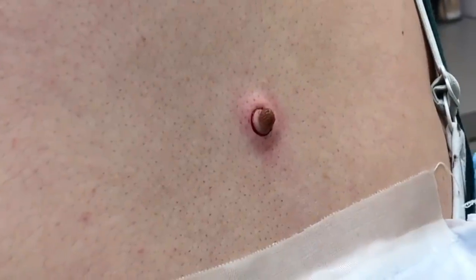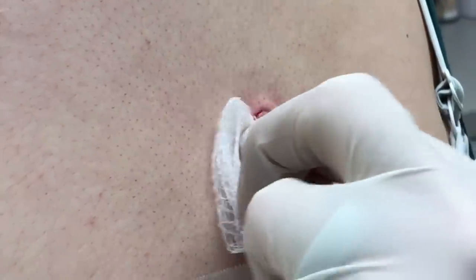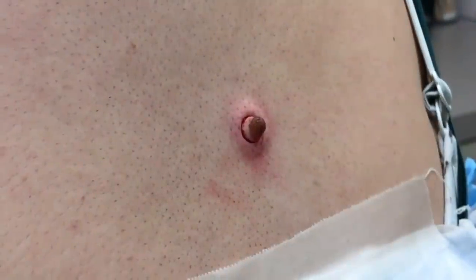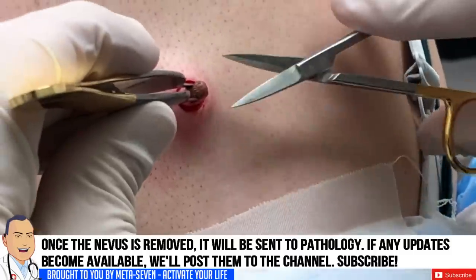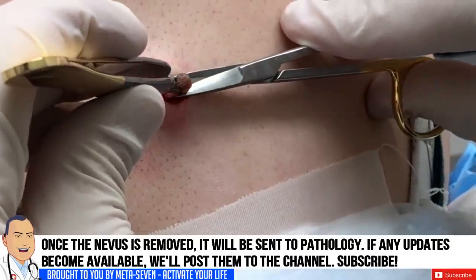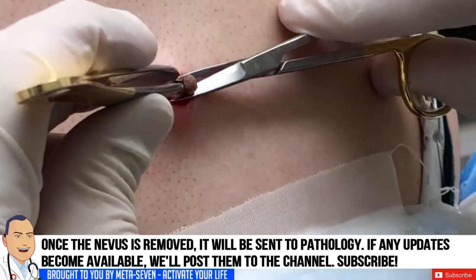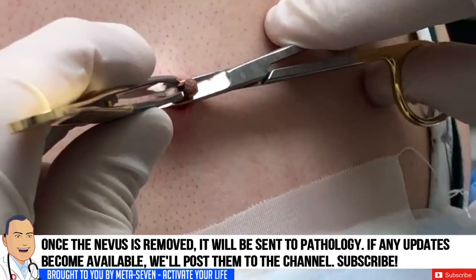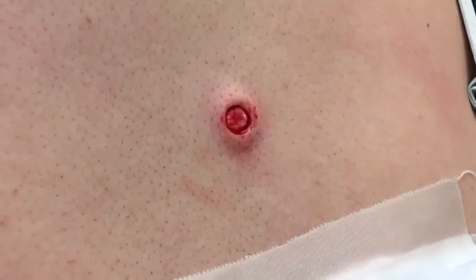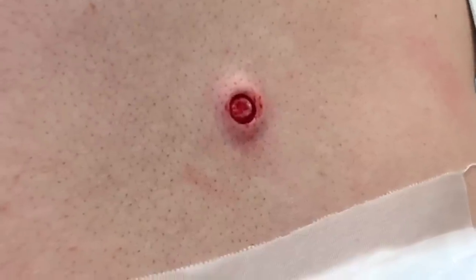So this is a very simple office procedure. It can be done in almost any office. Most offices would do this, right? This is very simple. So we're going to grasp firmly the lesion and we're going to snip it off with these scissors. Slowly. The mole has been removed.